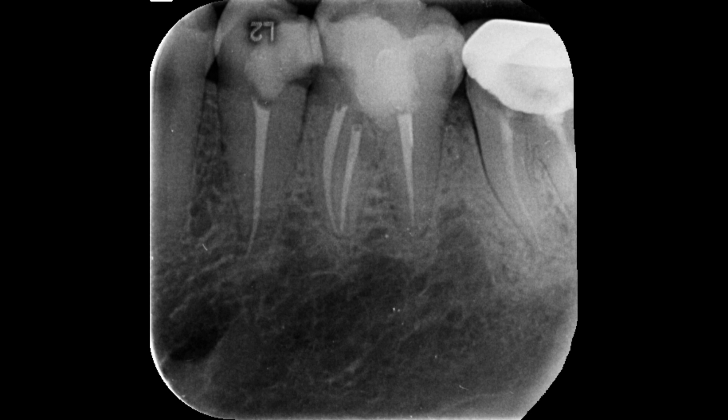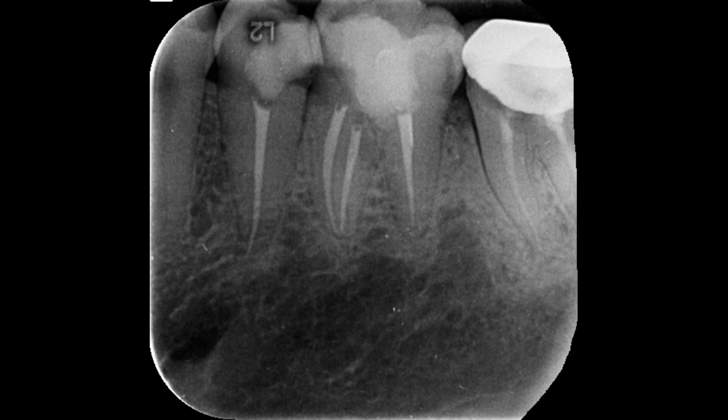Once I completed the obturation, I restored the teeth with temporary cement — that's the glass ionomer cement. The permanent restoration is to be done at the next appointment.